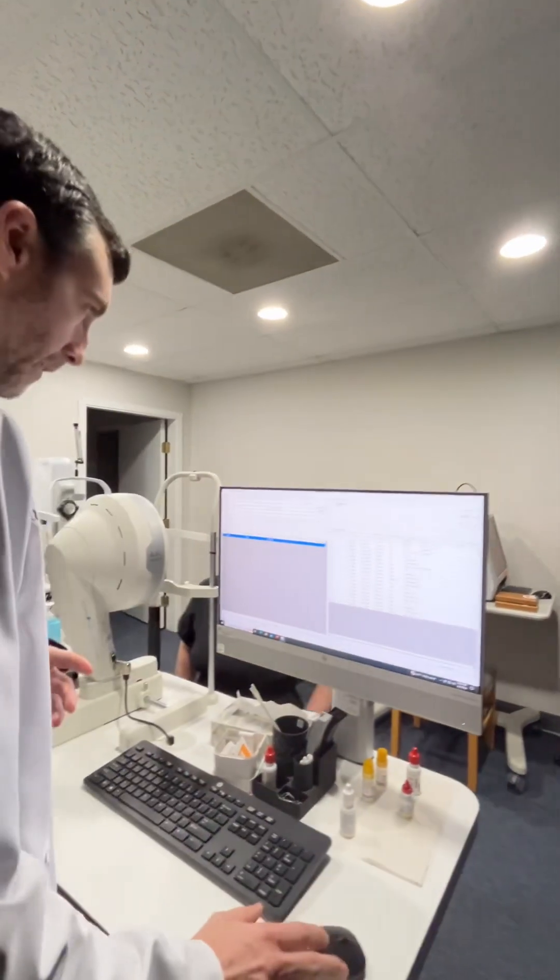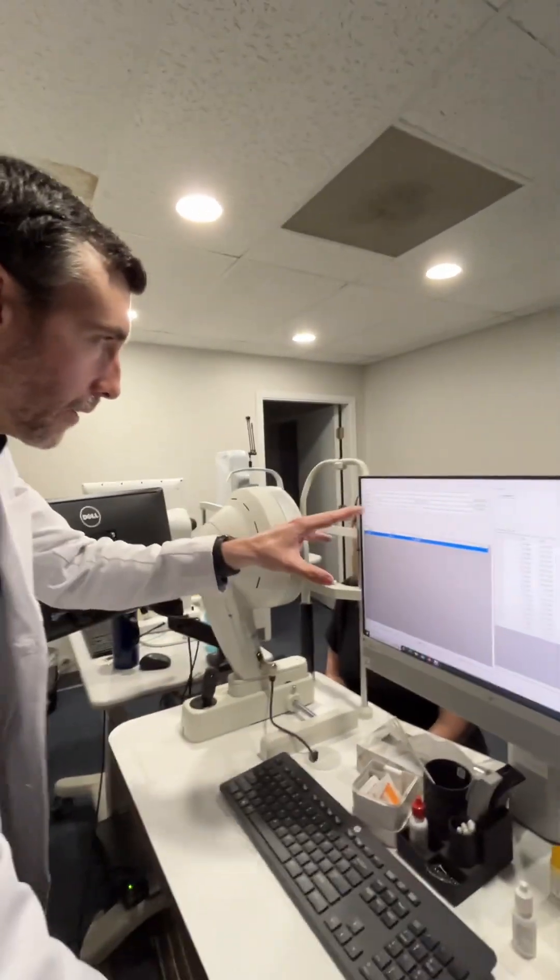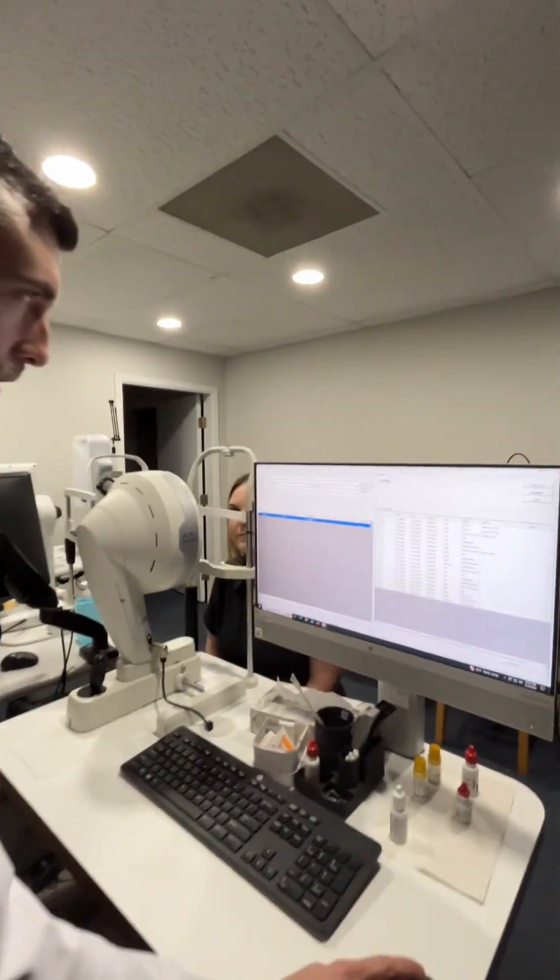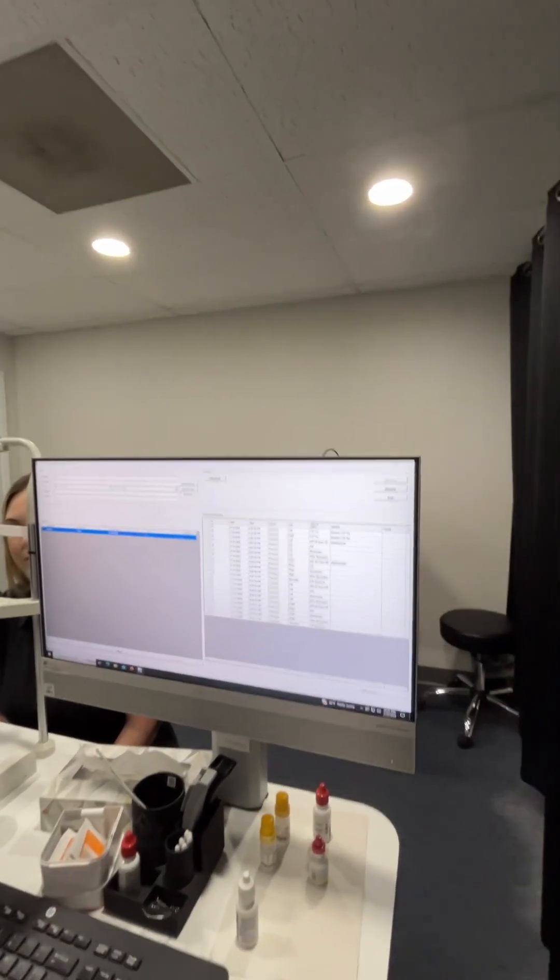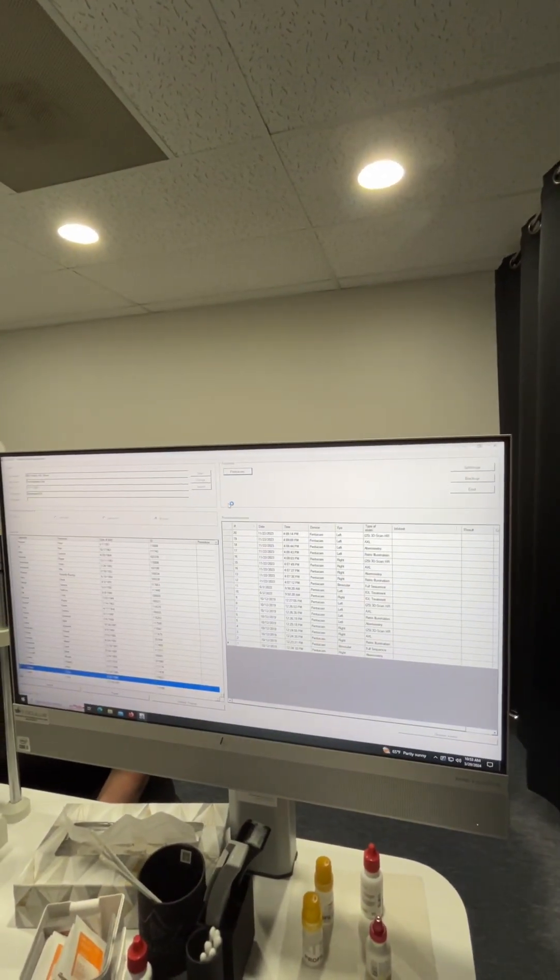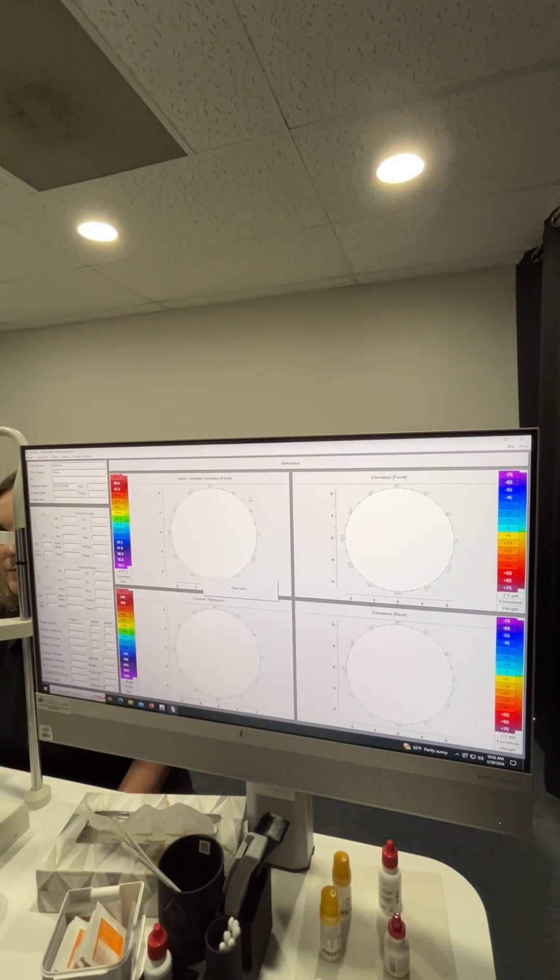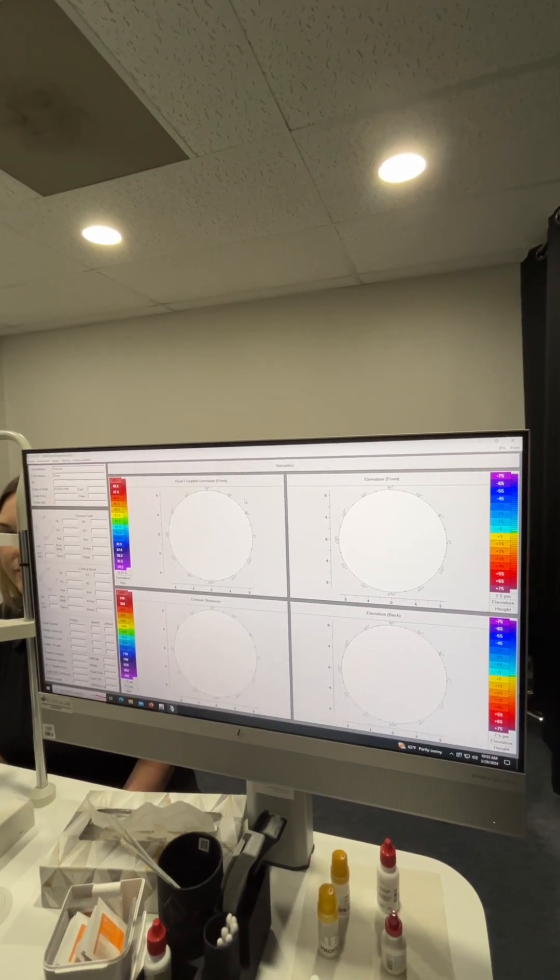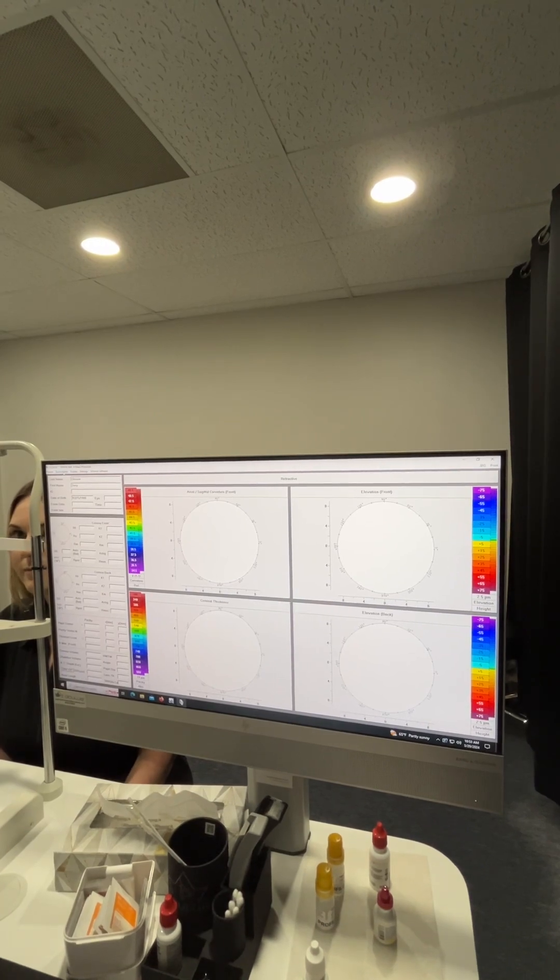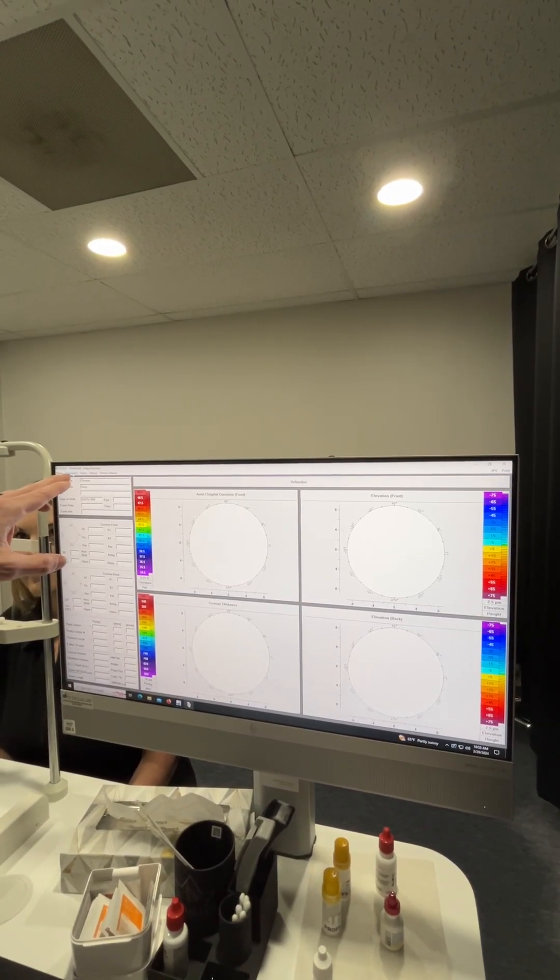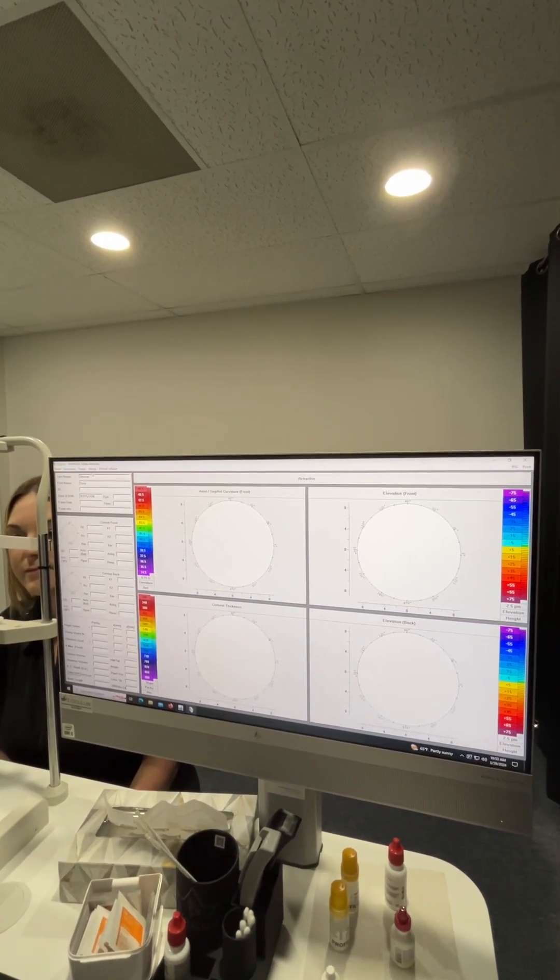Susie's been in the instrument before, so I didn't have to add her, but I did find her through the feature here and then you can go to this button that says Pentacam. Pentacam is kind of like opening up the acquisition component to the instrument as well as the review. At the top you'll see patient examination display settings.